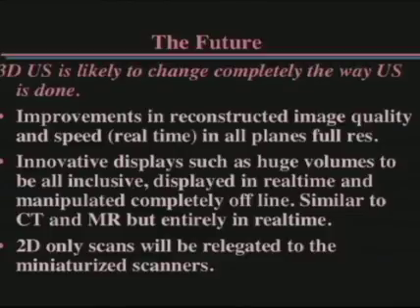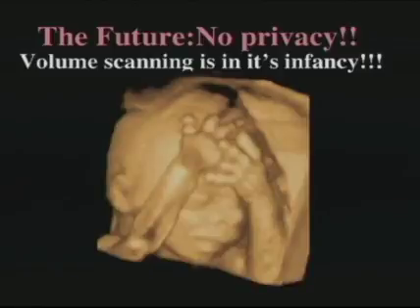We will have new innovative displays, such as huge volumes that will be all-inclusive, can even be displayed in real time perhaps, and manipulated completely offline, very similar to CT and MR, but perhaps completely in real time, which will be better than CT. And perhaps 2D only scanning instruments will be relegated to the tiny little miniaturized scanners that you can hold in your pocket. So lots of changes in the future.